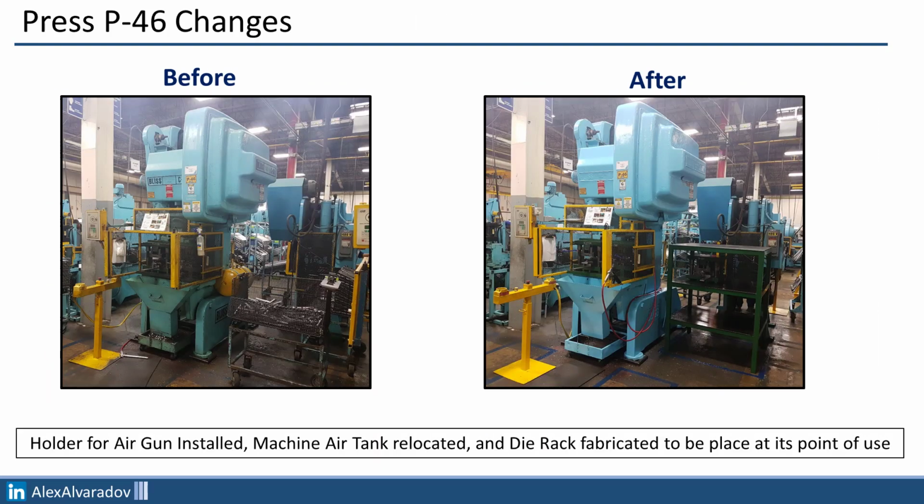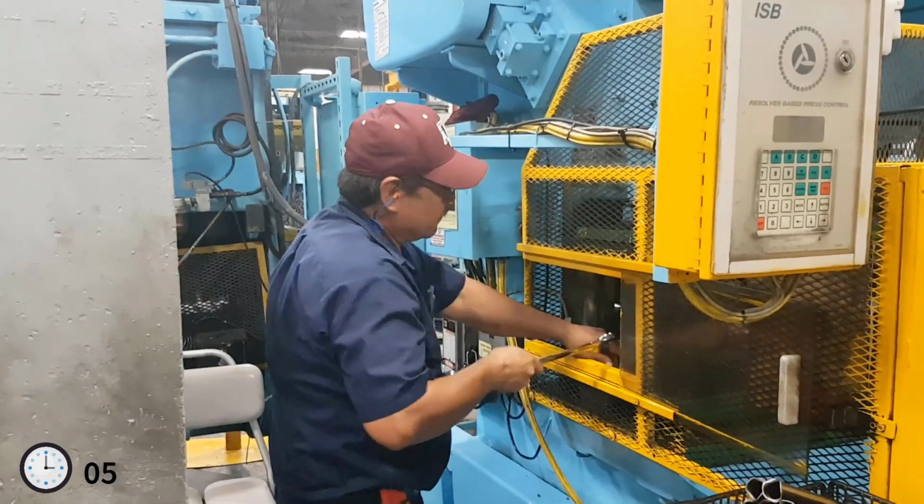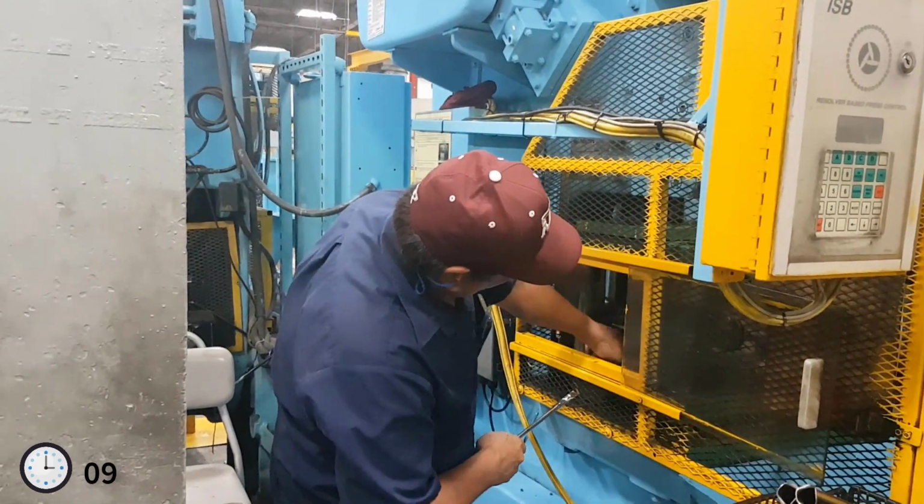Before situation, there wasn't any holster for the air gun and no space to install a rack for dice. The maintenance guys relocated the tank on the rear part of the press to free up some space, and then they placed a rack for dice just outside the machine to avoid excessive walking. On before situation, they were using a combination wrench to remove the bolts from this press.